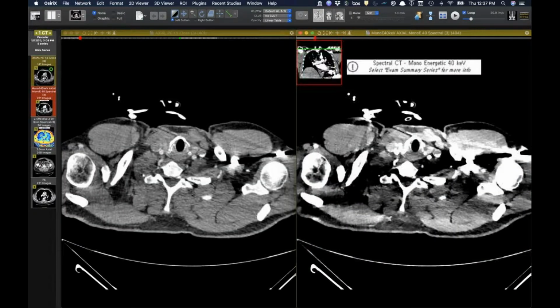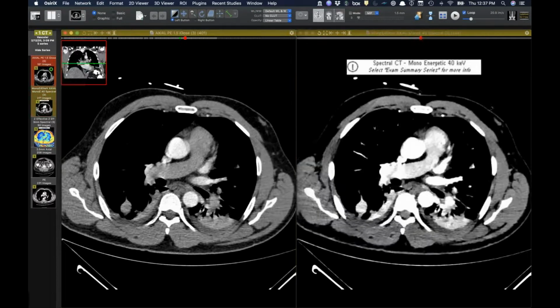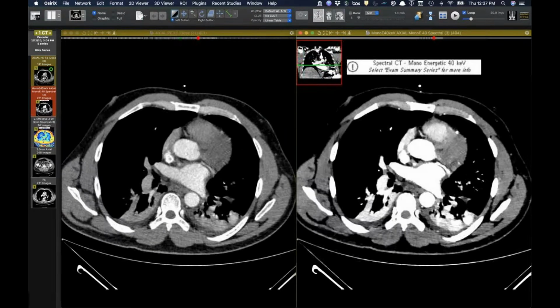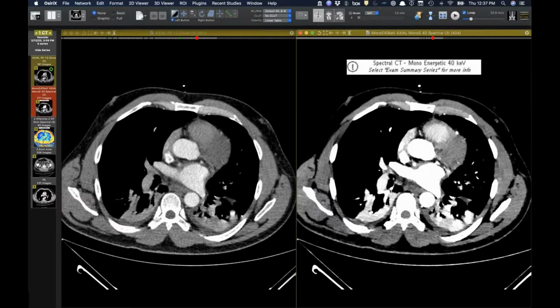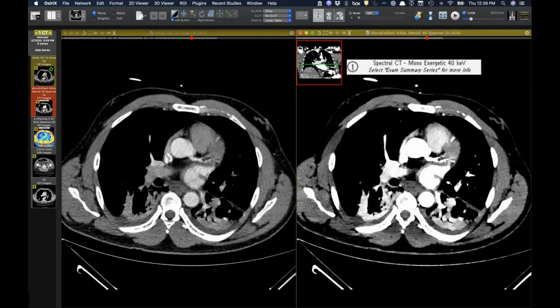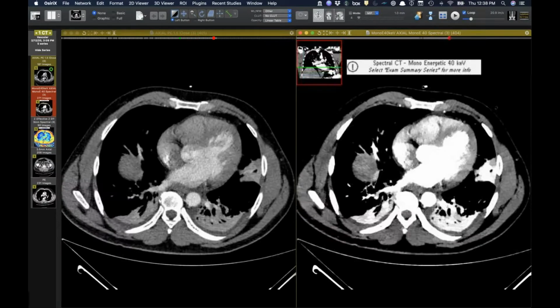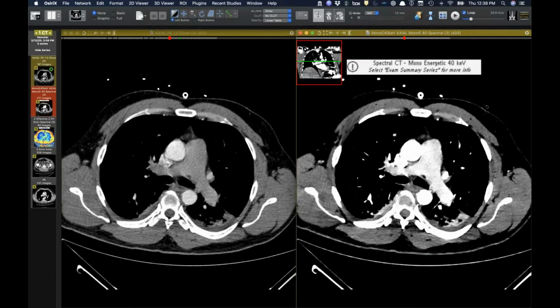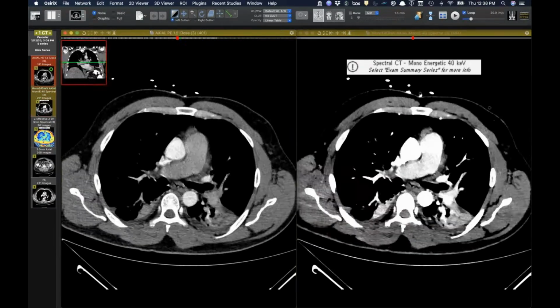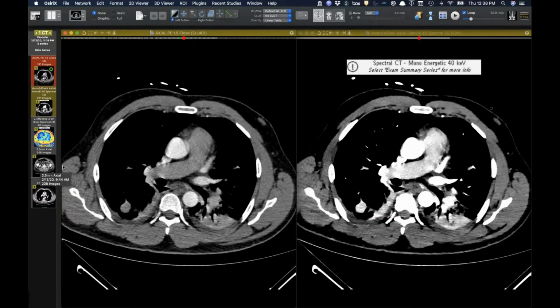So this was one from our VA, because we have a Philips scanner at the VA, and you can see this transient interruption of contrast. We tried the spectral, and I'm going to point you to the right middle lobe pulmonary artery here, because this is the spectral CT, monoenergetic 40 keV. Based on this, you'd say there's nothing here, and this is a pretty good look at the pulmonary arteries, even with the contrast bolus, at under 100 Hounsfield units in the pulmonary artery. So this was called negative.